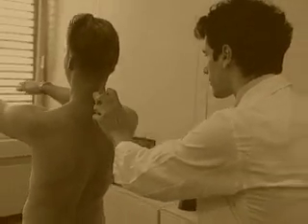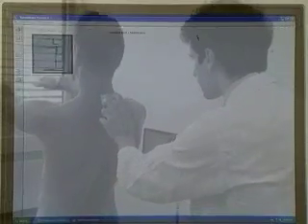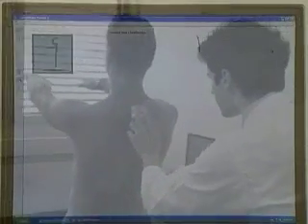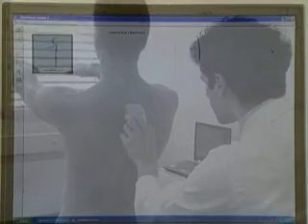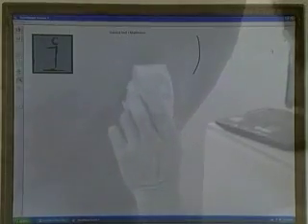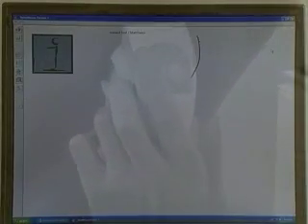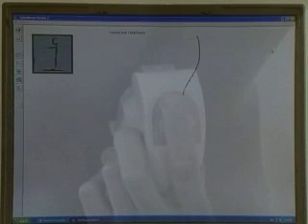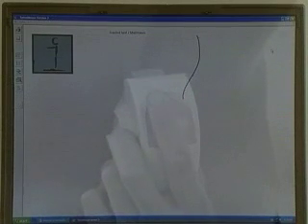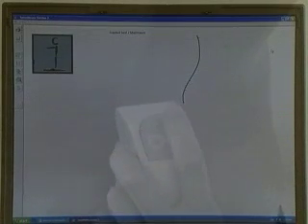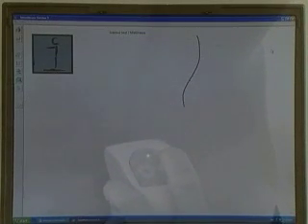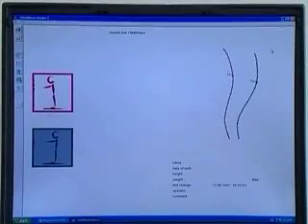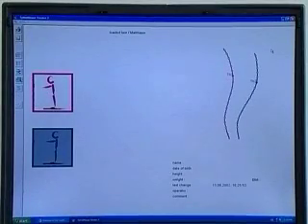Clinically relevant parameters such as length, inclination relative to a vertical line, sagittal and lateral curvature, segmental angles of the thoracic and lumbar spine, and pelvic tilt are registered and shown in easy to understand graphics.